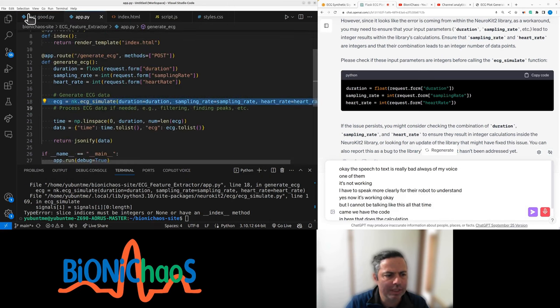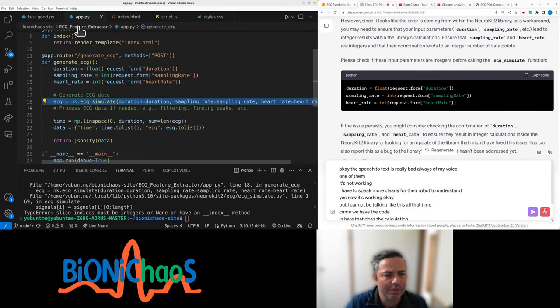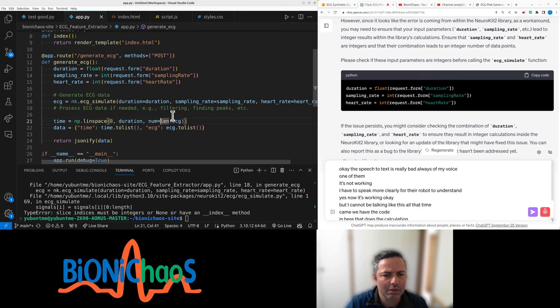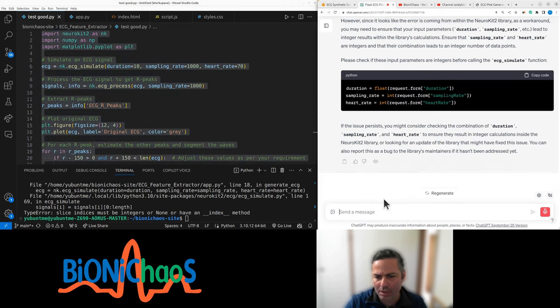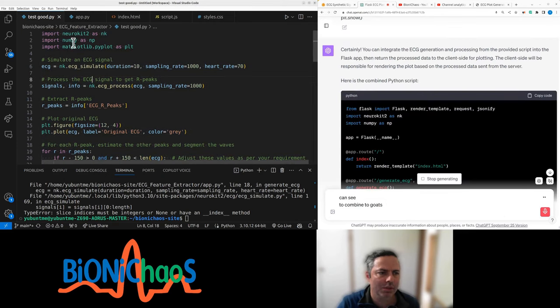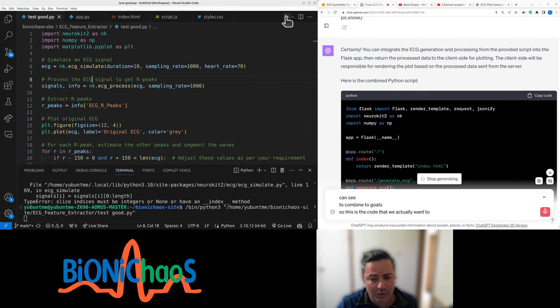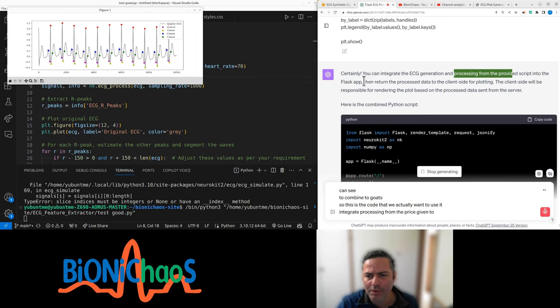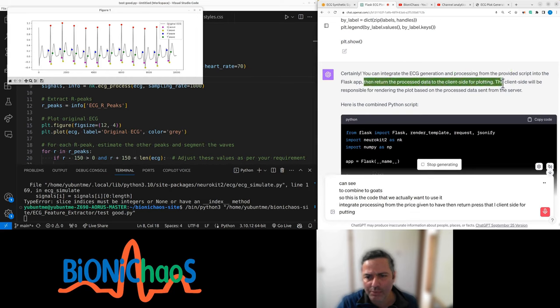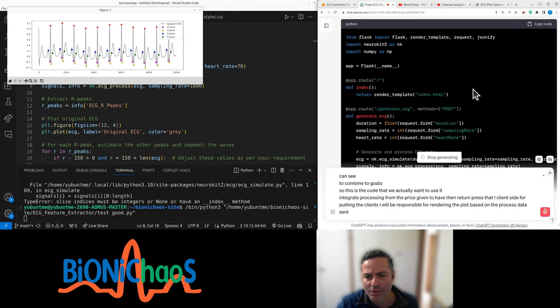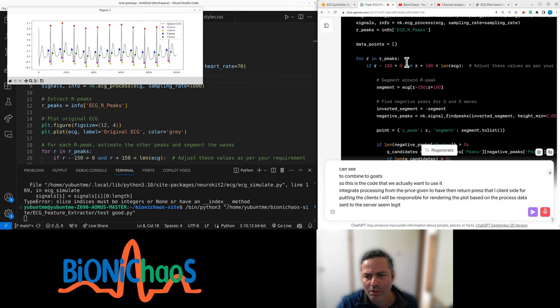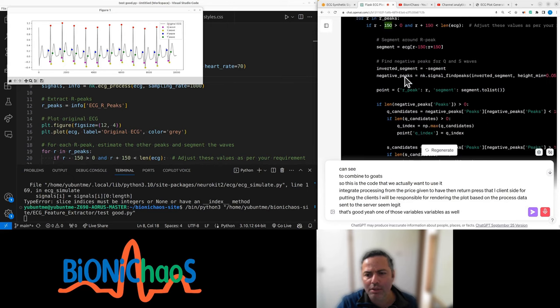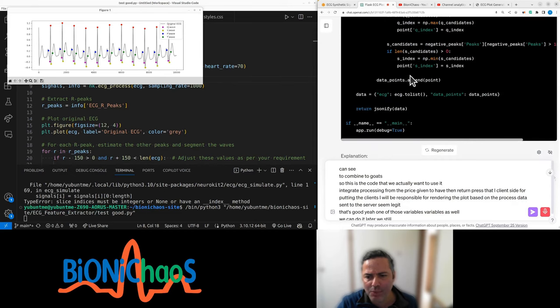The calculation should be in this Python code. We have the code in here that does the calculation. We have the ECG simulate, duration, sampling rate, heart rate, and so on. That's nice. Can we combine the current Python script with this one? This is the code that we actually want to use. Can integrate processing from the previous script into the Flask app, then return the processed data client side for plotting.